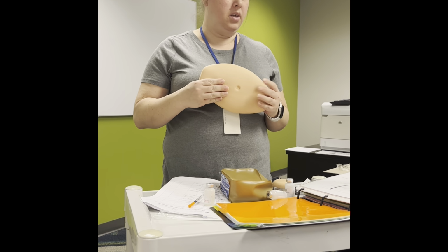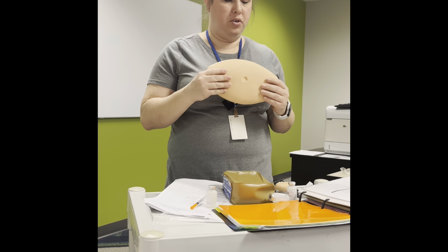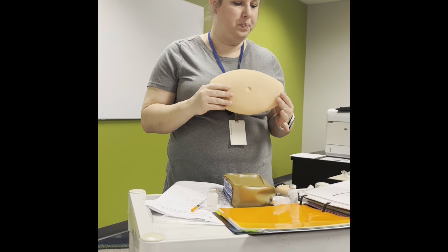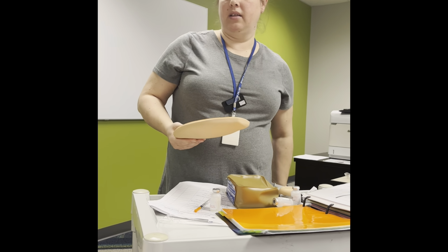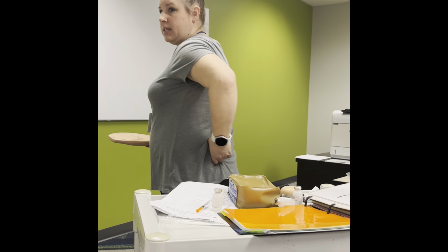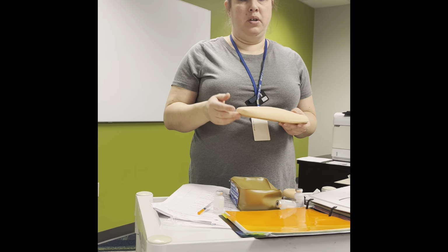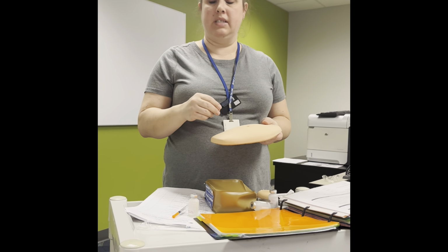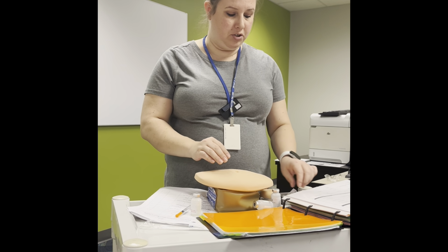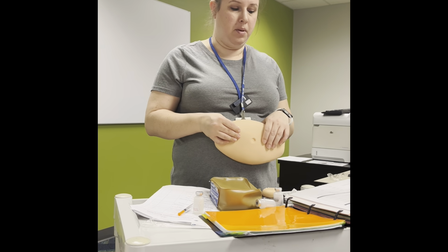Subcutaneous. So same thing, we wanna expose the site. We want to make sure there are no lesions, trauma, or inflammation. You're gonna tell me the location: back of arm, stomach, leg, back side of the flank area. If I was to do this, I wanna make sure 1 inch would be a 45-degree angle, 2 inches is 90. I'm gonna say that my patient has 2 inches. I'm gonna work in a circular motion 2 inches from the belly button.